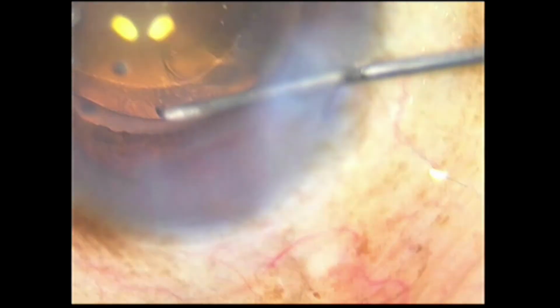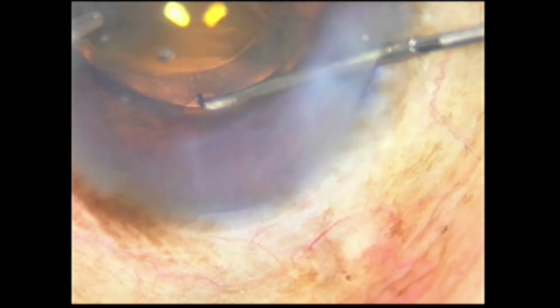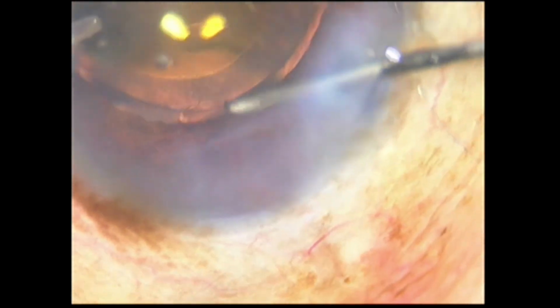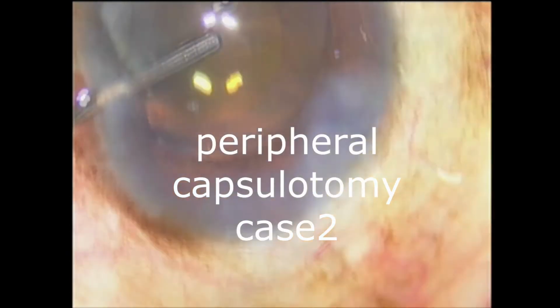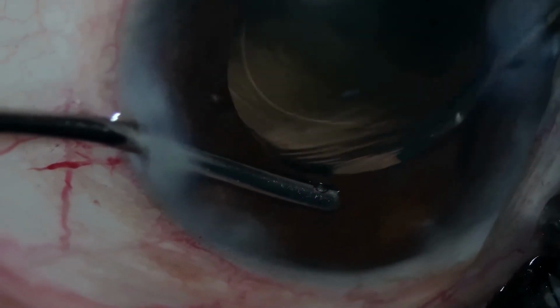In patients with high risk of capsular bag distension syndrome, like sulcus fixated IOL with optic capture in an intact capsular bag, eyes with greater axial length, or a smaller rhexis, a peripheral anterior capsulotomy can be created with a needle. A fresh 26 gauge capsulotomy needle is used to create a small opening in the anterior capsule peripheral to the edge of the optic after IOL implantation.